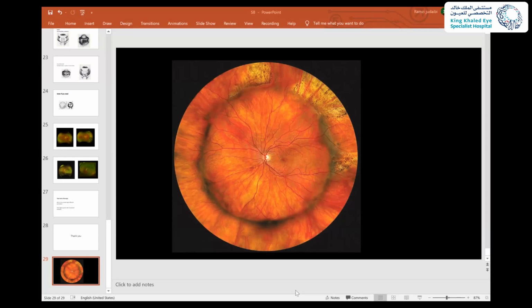Another question, something that's very modern and a lot of people are doing, is in regards to how you fix the buckle onto the sclera. Traditionally, we suture the buckle onto the sclera, but more recently people have begun to do scleral tunnels with crescent blades. What's your take on that, and what's your preference? What do you feel?